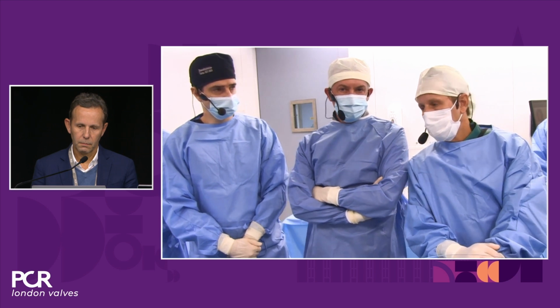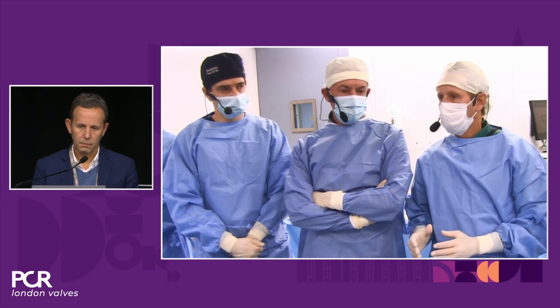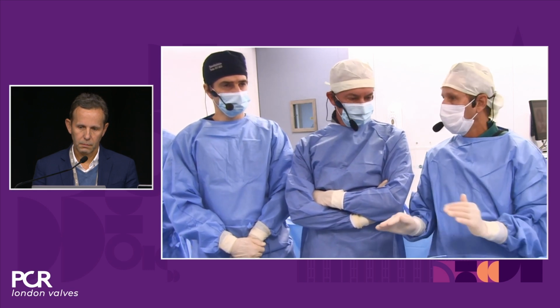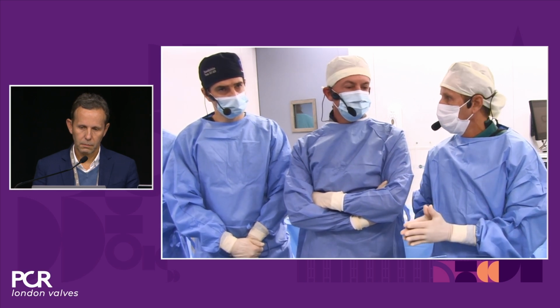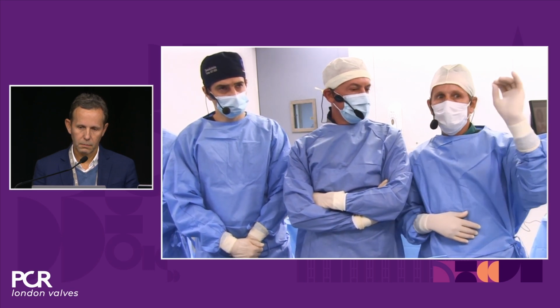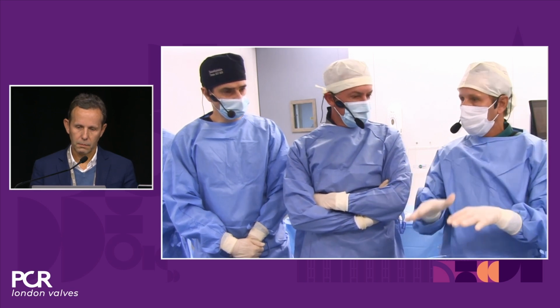Yes, Alex, we are using here a protocol that is based mostly on non-contrast CT for the planning of the procedure. We use zero contrast at all, and we do the whole procedure without any contrast, based on fluoroscopy, the position of the pigtail, and guided by transesophageal echo. So I think we're going to show this during the case.